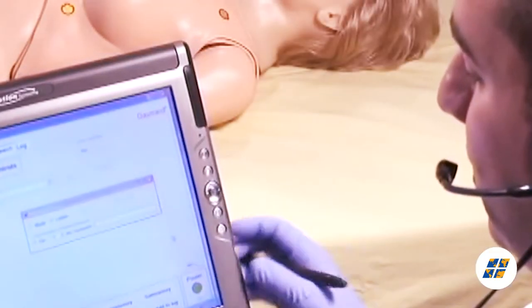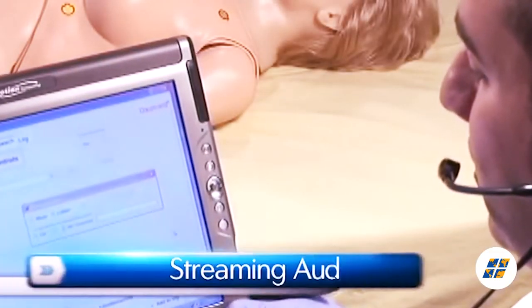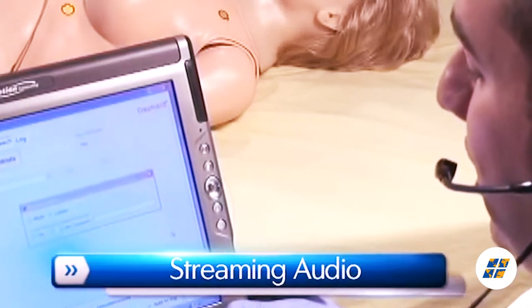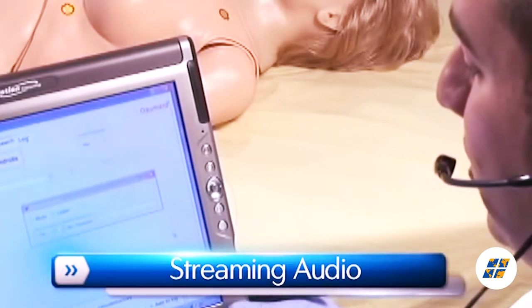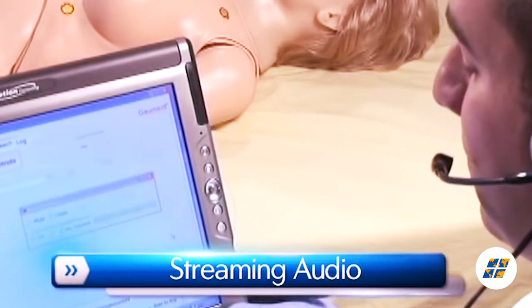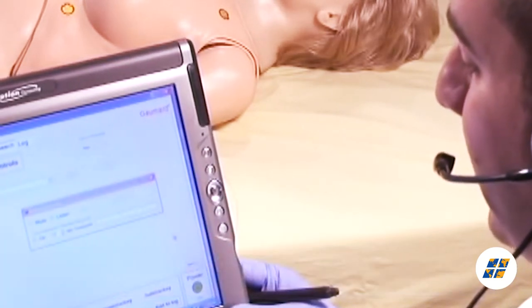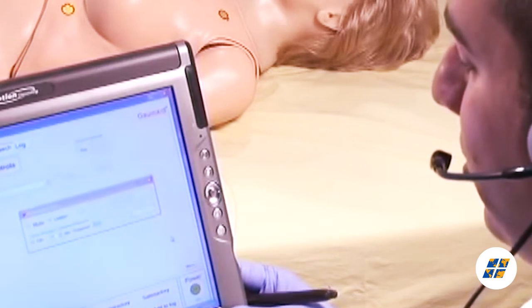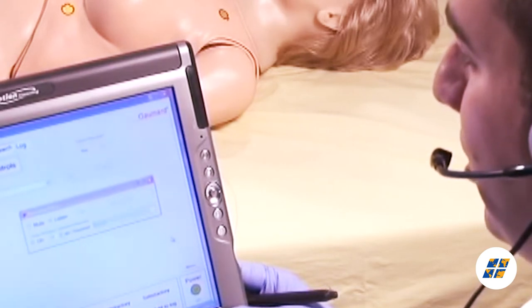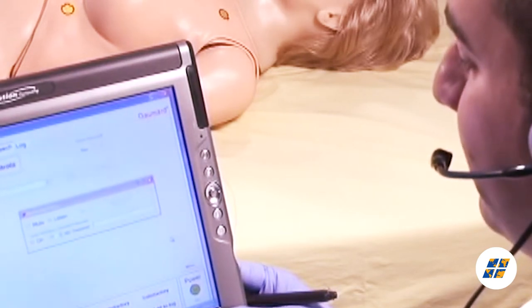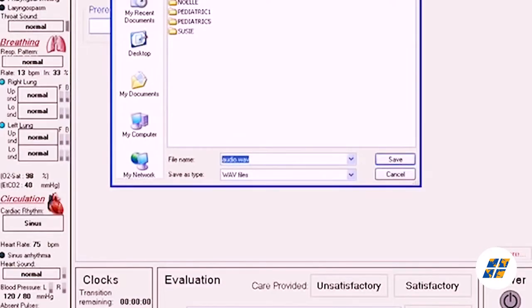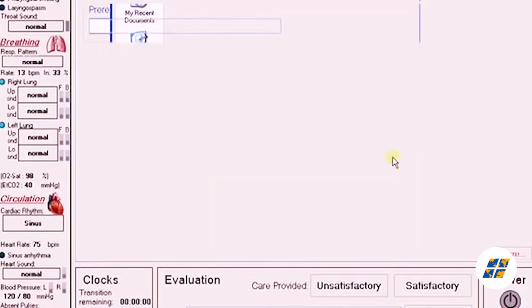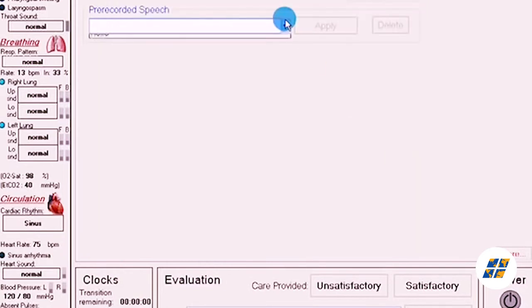Suzy has the capability of streaming audio, so you can be the voice of Suzy and her responses at a distance of up to 50 meters. This feature allows you to create and store vocal responses in any language, or select from a pre-recorded vocal menu.